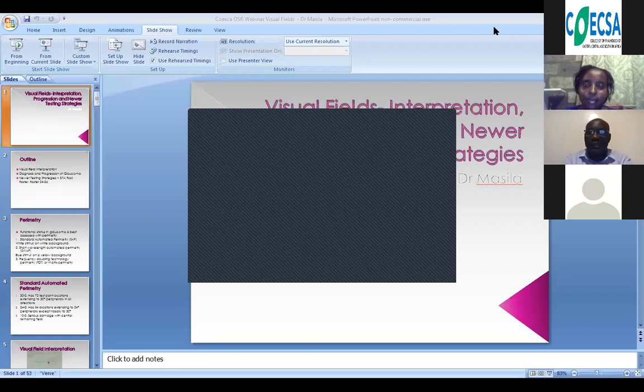Faith, what do you think for the visual field? So my indication is the same. The only thing I sometimes add is that I tell the patient to do a field even if it's much later, because for some patients it's part of the counseling. When you tell them and their relatives that your field is a bit reduced here and there, they also believe, so it does help in complying with the treatment. I also use it as part of my counseling regimen, but not early. If the patient can't afford it, I don't put it early.